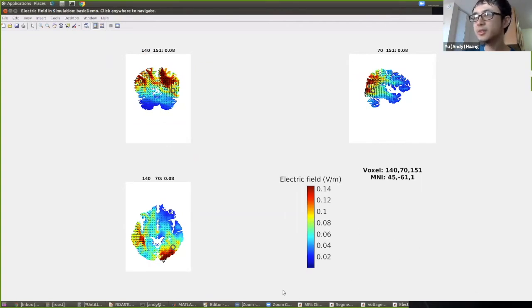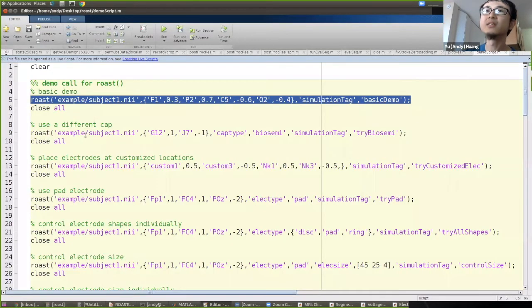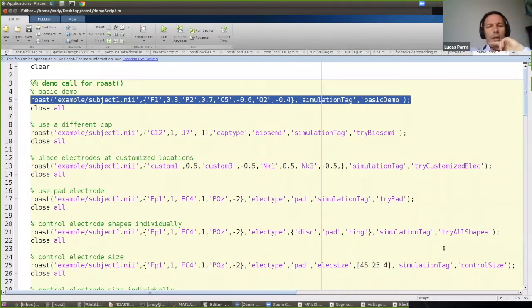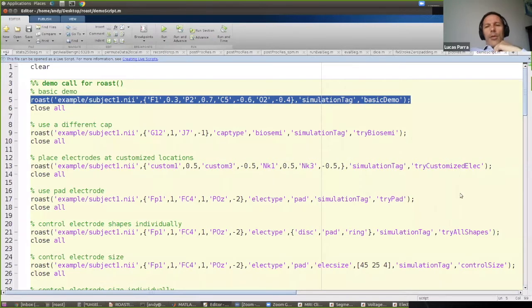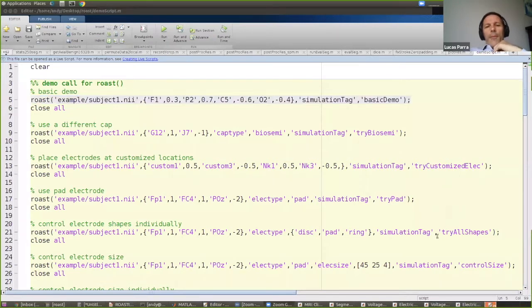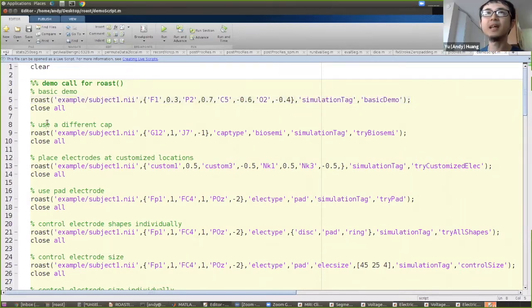That was the first basic demonstration. An audience note: please ask questions in the chat and they'll be relayed. Now, what if we want to use a different electrode cap? By default, ROAST uses the international 10-10 EEG system.